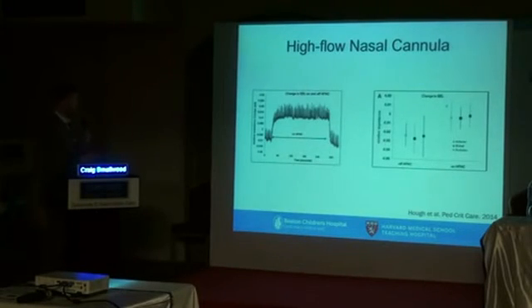But you can see here, we're looking at the end expiratory lung volume, a surrogate, using the impedance. And you can see one of the theories of mechanisms of action is that high-flow nasal cannula actually does apply an end expiratory pressure type therapy that previously people didn't suspect.